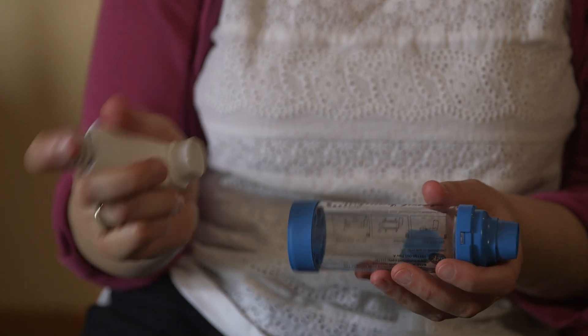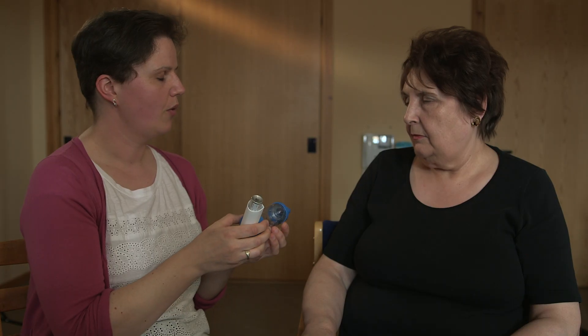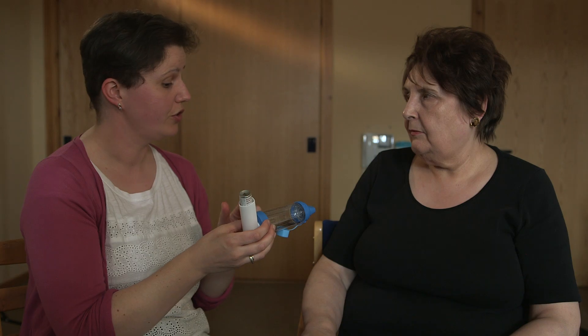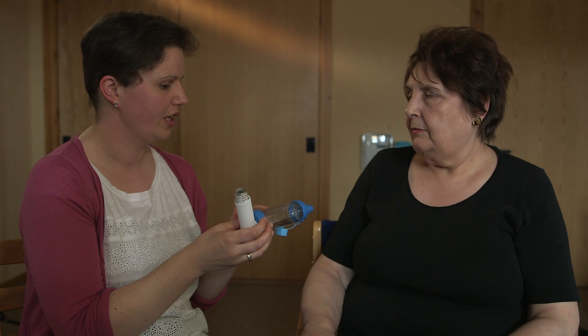Now we're ready to give you your inhaler. I'm just going to give it a shake and put it in the spacer. Now what I want you to do is to breathe out, put the spacer into your mouth and start to breathe in through the spacer, and as you're starting to breathe in, I'll press down on the inhaler and you just keep taking the whole of your in-breath through that spacer.